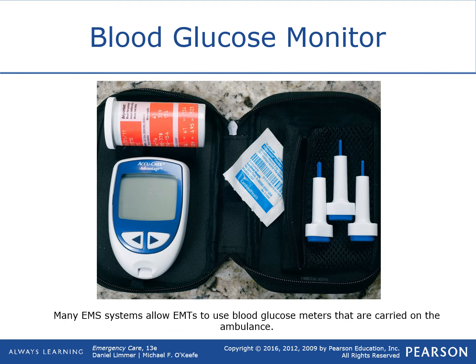Here's a picture of a blood glucose kit. So, some things you want in your kit. Right here you have an alcohol prep to disinfect skin. You should also have 2x2 gauze to stop bleeds after you puncture the skin. Right here, this is called a lancet. These are safety needles. So there's a spring right here connected to a small needle that ends here.